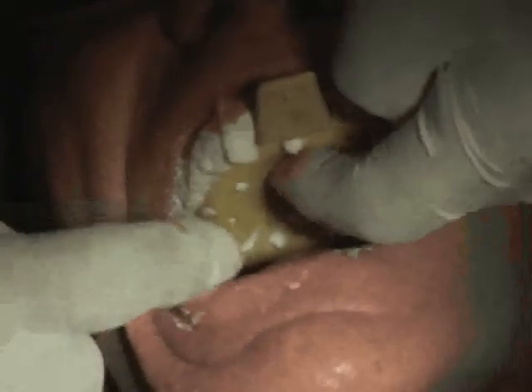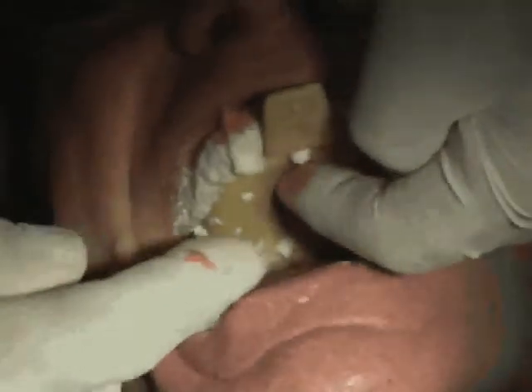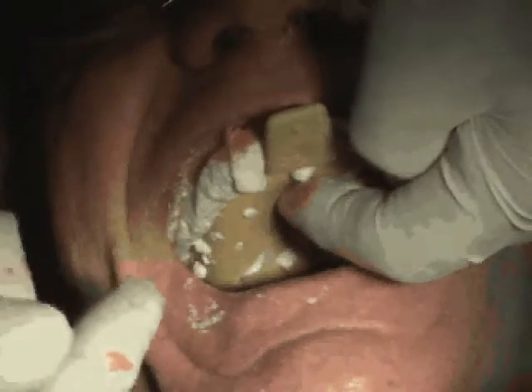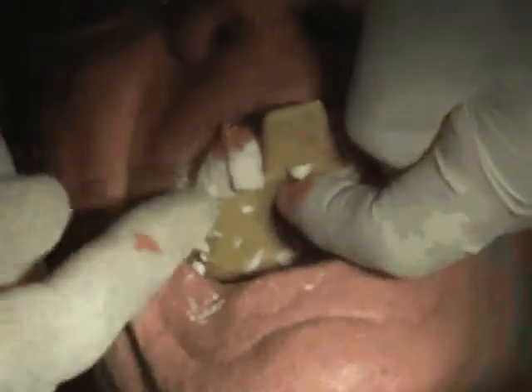Mr. Gray actually is not a gagger, but for gaggers, we just tell the patient to breathe through their nose, and the tongue comes up in the back and blocks the material from going down the throat. And say, just breathe through your nose and this will be comfortable. I've rarely ever had anybody gag on this material.